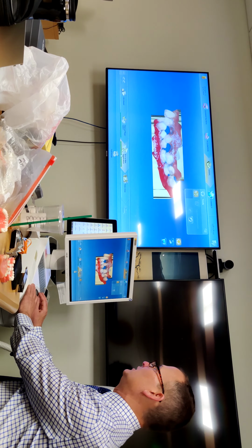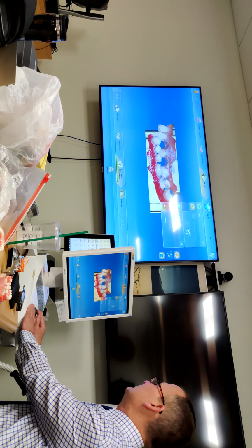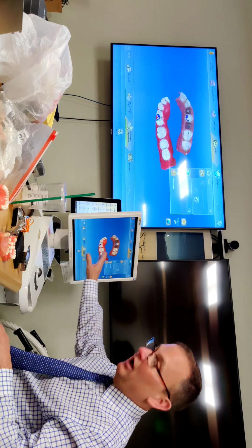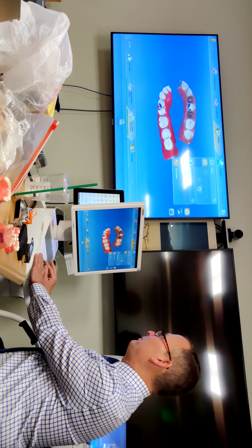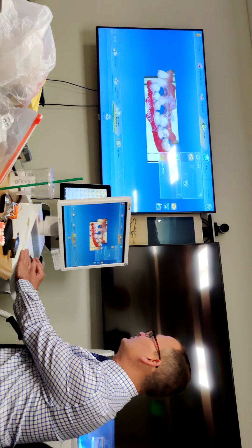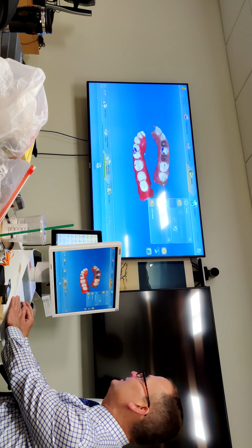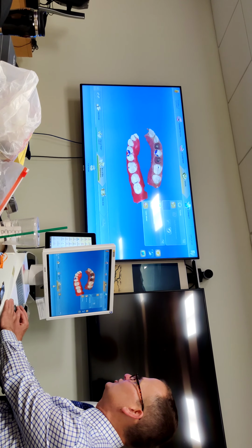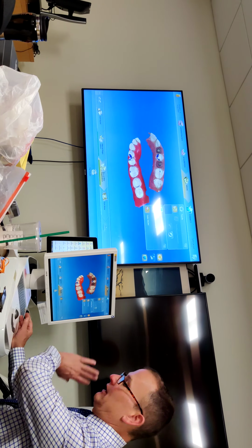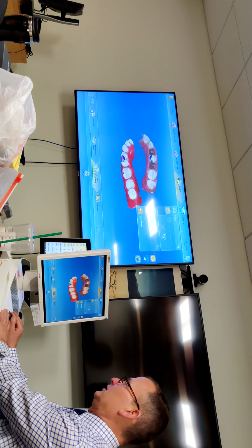It's done. And because there's the bite, okay? I don't like looking at the bite like this. I like looking at the bite like this. If you leave it like this, this is the way it's going to come up until somebody changes it. So if you get to the buccal bite registration and it looks like this, then just come here to display, to analyzing tools, and do model contacts, because I want to see were the teeth really touching on either side of whatever I'm doing, right? Was he really biting down? If he's not biting down, I'm going to retake my bite, okay? But this is automatically done now, but you can still look at it.